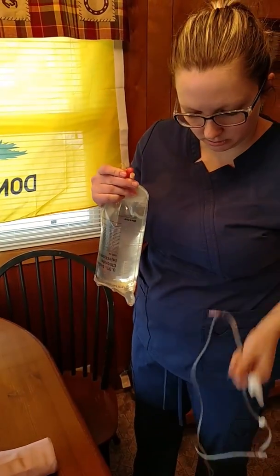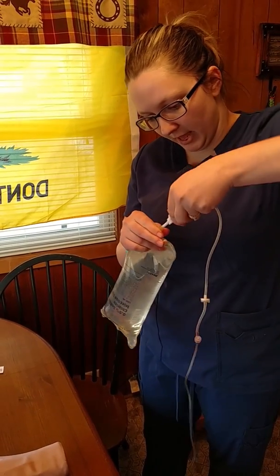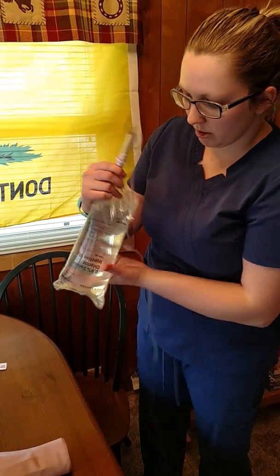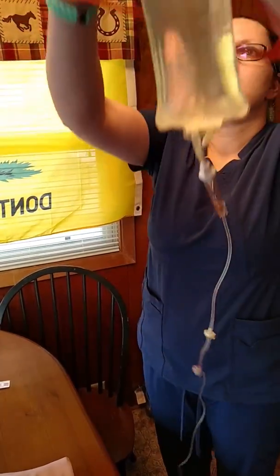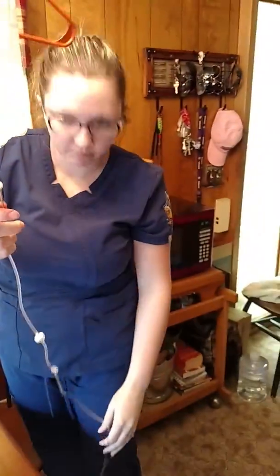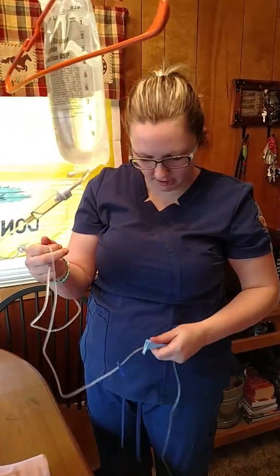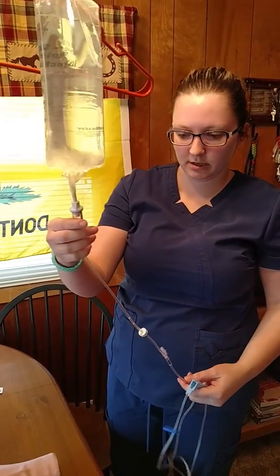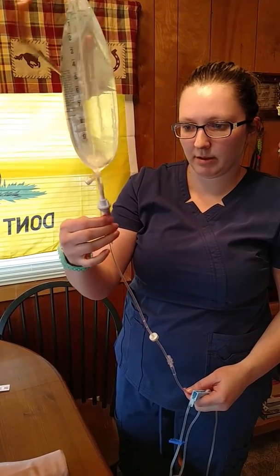Alright, so as long as we keep this sterile, I'll spike my bag. And hang it. Then I would have locked my IV here before I started so we don't get air bubbles in it. And prime it about halfway.